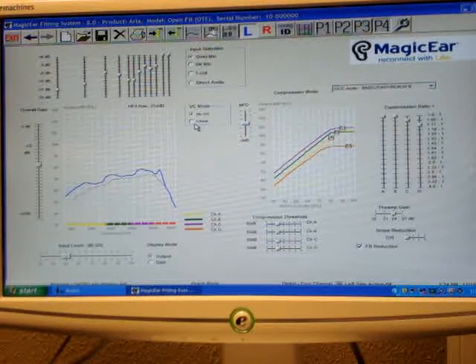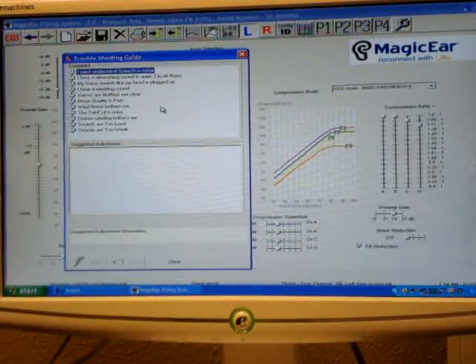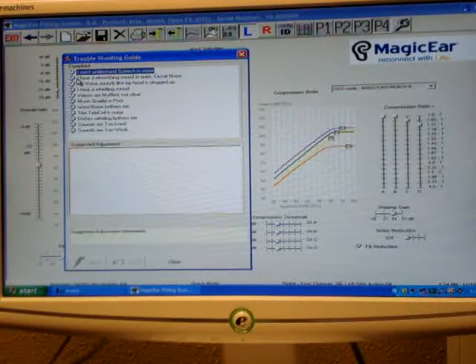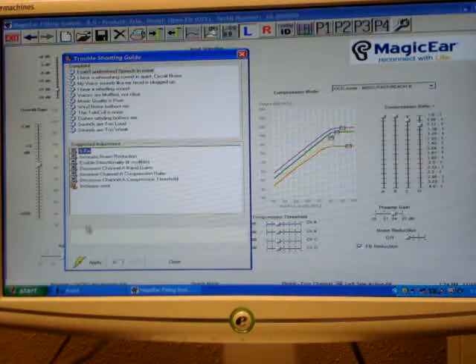And if it's a custom hearing aid, you have your choice of having a volume control or no volume control. And then if a customer comes in and has a certain complaint, this wrench is like an auto doctor for troubleshooting. So if somebody can't understand speech, you click on it and it will give you different options to adjust. You click on S-Fix, that's the software fix, and apply, and it will automatically make the change for you.